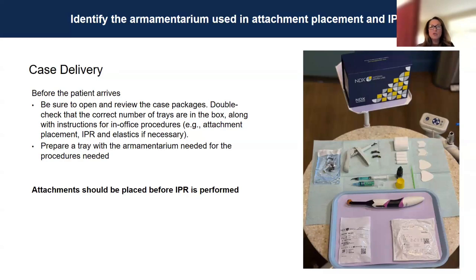But another reason why I like to look to see how many attachments I'm going to have is that way I know how long of an appointment I'm going to need. Because we don't want to get running behind on a patient, because I thought we were only going to do 3 attachments and in reality we have 10.